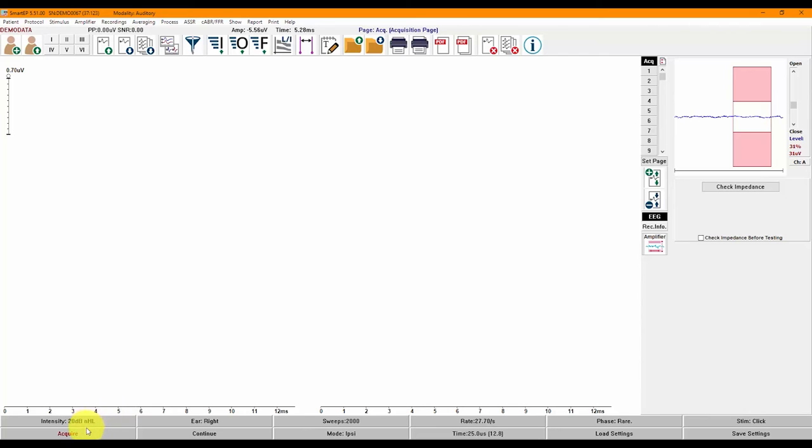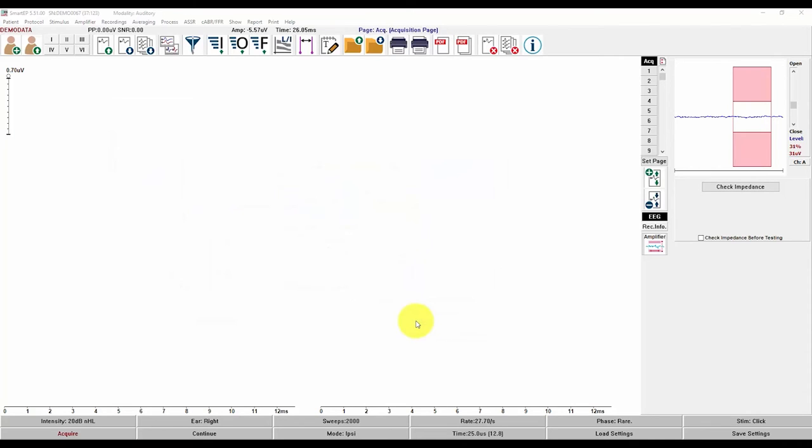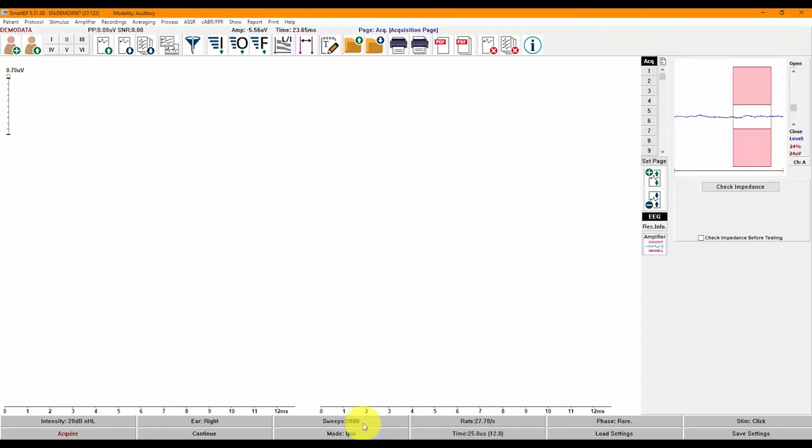At the bottom of the screen, you will find a simplified control panel that provides direct main screen access to change any parameter. To quickly begin a test, you can click on Load Settings and choose from a list of pre-configured test protocols. You can also easily modify any parameter right from the control panel without needing to go into submenus or other windows.